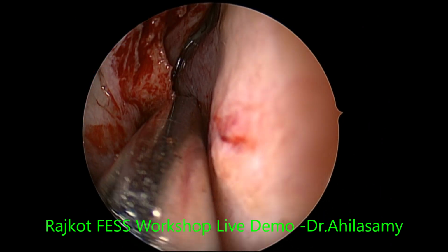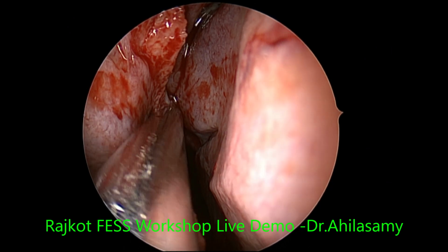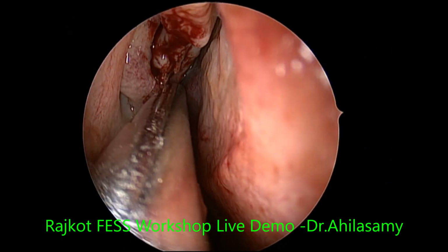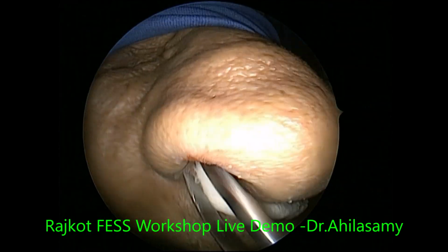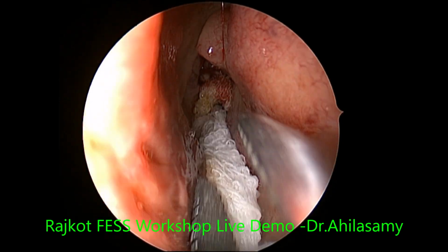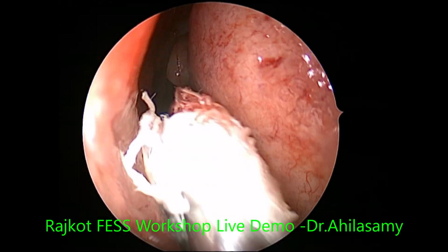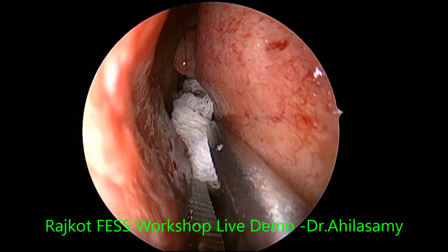Be very gentle. If you come down too much, then you may injure the septal branch of the sphenopalatine artery. If you injure it, then you again keep a pack for a few minutes. The bleeding will stop. Nothing to worry. So whenever there is a little blood, you just pack with a pack dipped in a solution of 4% lignocaine and adrenaline in the ratio of 1:1.